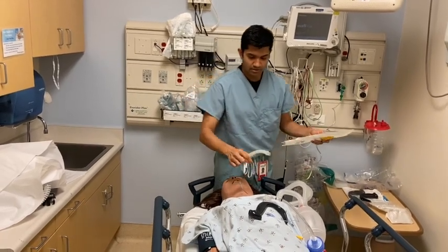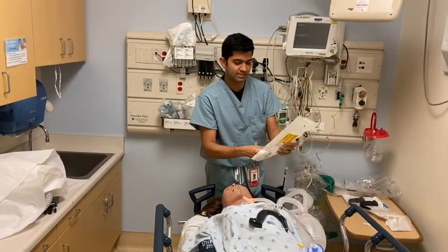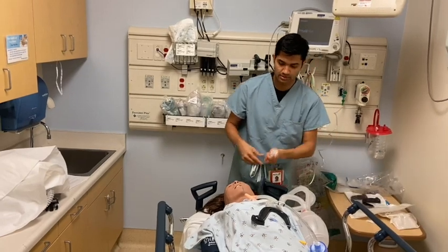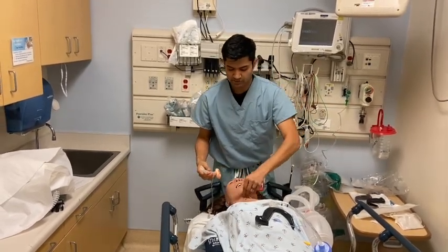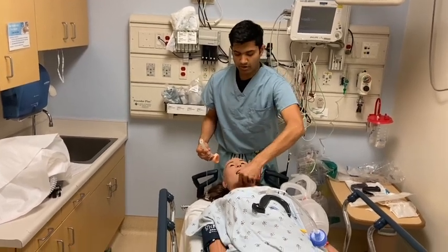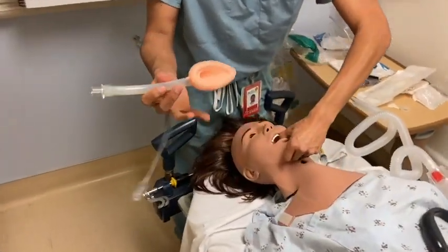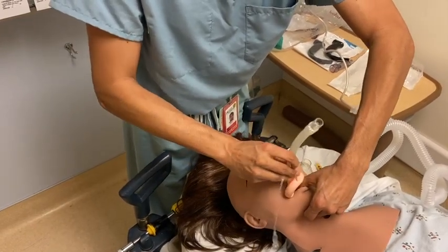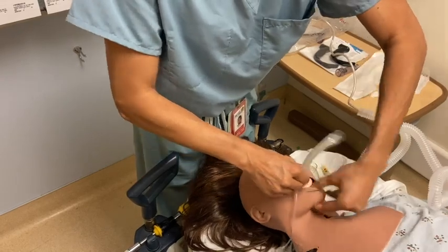In a mannequin it is a little difficult, but in humans as well, you want to have some lubricant jelly, which is in all of the airway kits. What you would do in a human being as well as a mannequin, I'm doing the same thing here: putting my thumb in, grabbing the jaw up and out to create a big space over here, and then taking the LMA, you can go backwards and twist it around, or just go straight in and push it all the way down into the hypopharynx.